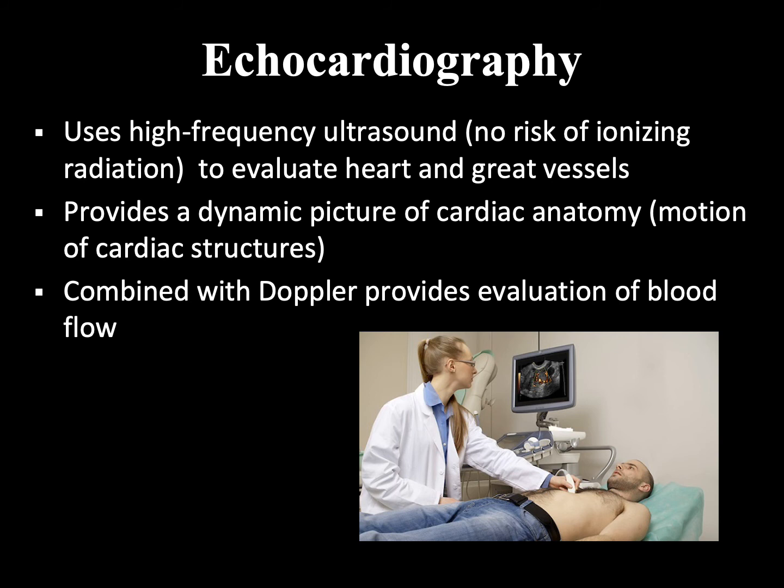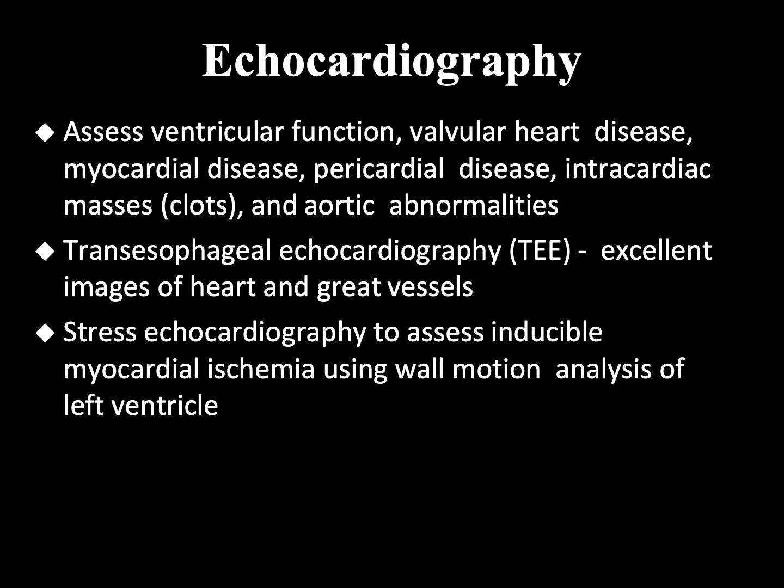And then echocardiography here. Using high frequency ultrasound to evaluate your heart and great vessels, it gets you a good picture on the screen of cardiac anatomy and the motion of these structures, so they can really look at the valves and blood flow through the heart. Like I say, assessing the valves, ventricular function, looking for any type of disease. There are several different types of echocardiography that we're not going to really look at specifically, but there's ways to evaluate this with the echocardiogram.